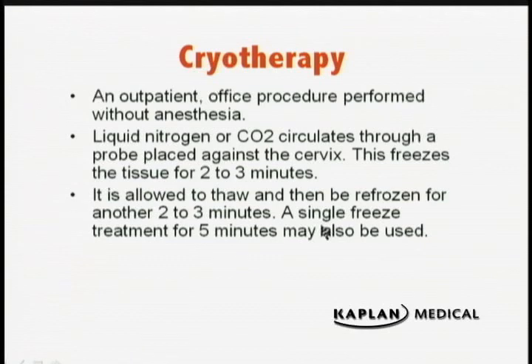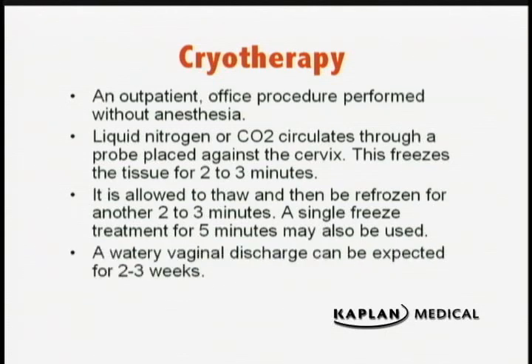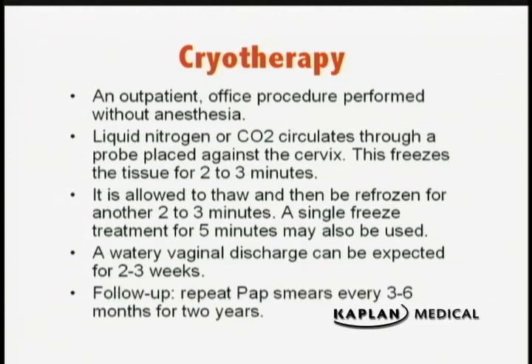What do you think this does to the cervical tissue? It destroys it. That's the whole point. It causes it to die, and what will happen then in the next few weeks? A watery vaginal discharge as all of this is shedding off. Now, do you know that you've destroyed the tissue? You really don't know because you haven't taken it out. You're hoping that it will slough off. But the only way you can know for sure is you do repeat pap smears every 3 to 6 months for a couple of years, just like you did with the LEEP.